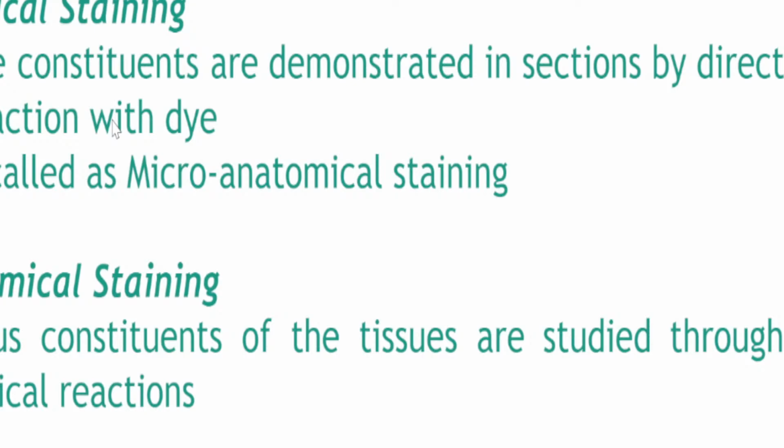Now, next naman natin is the immunohistochemical stain. Immunohistochemical stain combines the principles of both immunology and histochemistry. Ano yun, sir? Merong antibody-antigen reaction, class. Okay? So what you are using here is not really a stain, but more so an antibody carrier carrying a dye. Okay? So if the antibody, say for example, you're detecting HER2 cells on a breast tissue, okay?